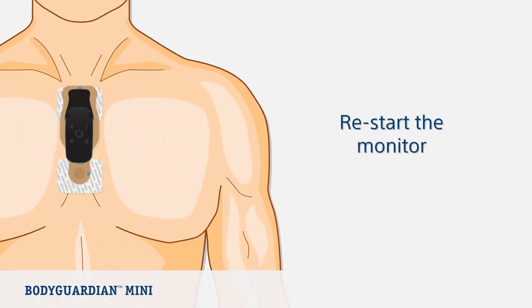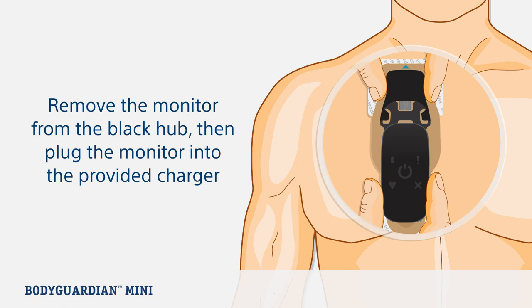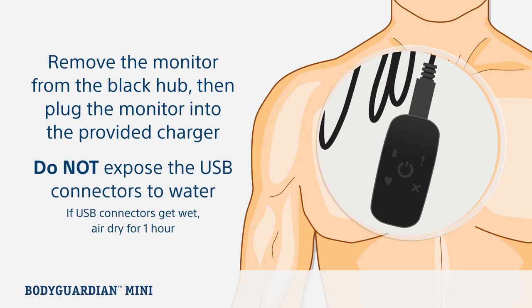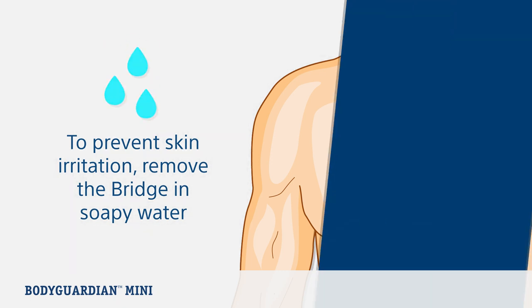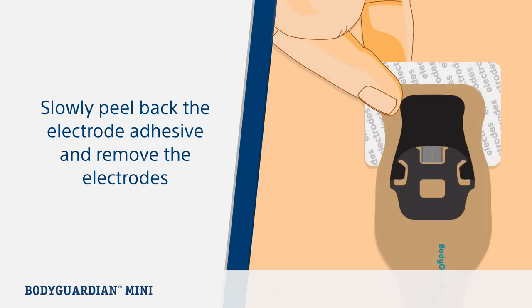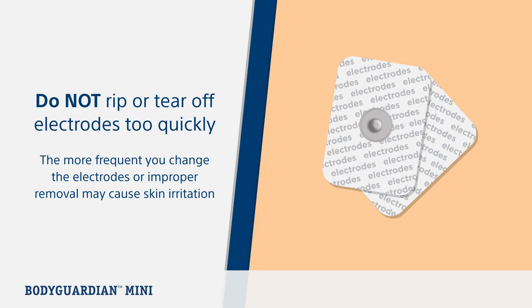Now let's look at changing the ECG electrodes. We recommend changing the ECG electrodes every three days or when they no longer adhere to the skin. Electrodes are disposable. First, remove the monitor from the black hub, then plug the monitor into the provided charger. To protect signal quality, it's important not to expose the USB connectors directly to water. To limit the potential for skin irritation issues, you can remove the bridge while showering or with lukewarm soapy water. The bridge is easiest to remove by slowly peeling and rolling back the electrode adhesive furthest from the black hub, then remove the top electrode. Use new electrodes each time to reattach the BodyGuardian Mini with bridge to your chest. Do not rip or tear off electrodes too quickly, as frequent changes or improper removal may result in skin irritation.